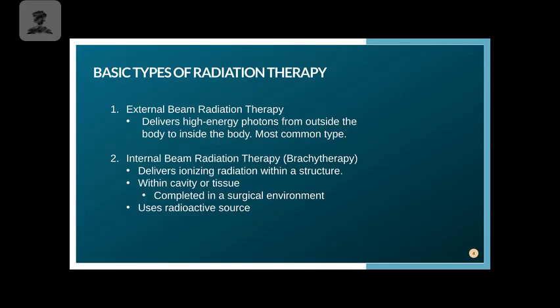We have to actually introduce a radioactive source within the cavity or within the tissue. When we're doing this, the patient's going to be asleep. We're not just going to inject things, especially because they're not super small needles. They're a bigger lumen that allows for the radioactive source to be implanted and then removed.